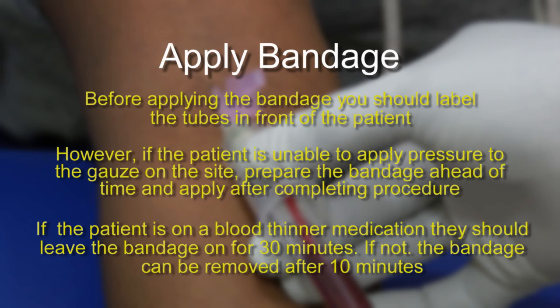While applying the bandage, you should ask the patient if they are on any blood thinners, such as Coumadin. If the response is yes, then ask the patient to keep the bandage on for a minimum of 30 minutes. If the patient is not on any blood thinners, then the patient can remove the bandage after 10 minutes.